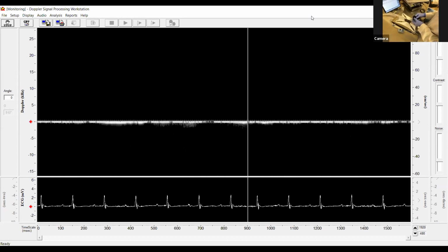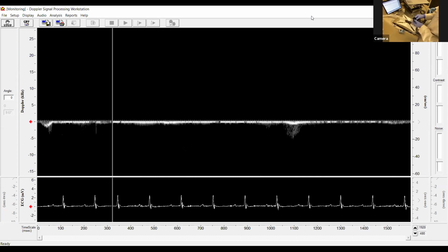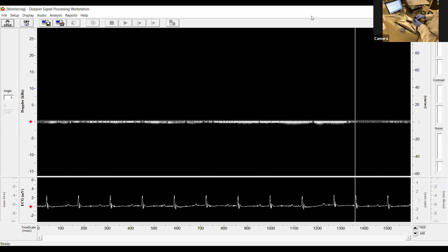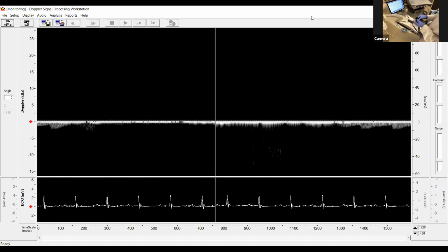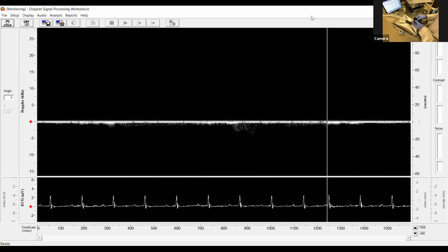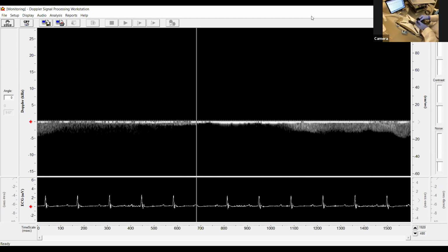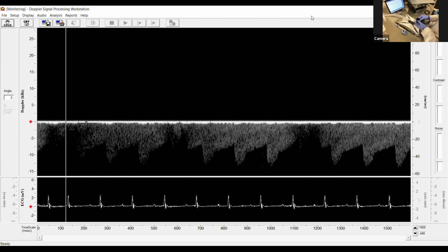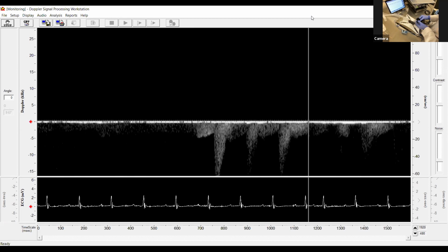Okay, so we should see the signal from this probe come out through the negative signal. So we're losing information about directionality of flow, but we are keeping velocity and the timing of the signal. As soon as Sydney gets a nice signal, she'll lock that in. What she's seeing there is actually venous flow moving into aorta, into arterial flow. There we go.